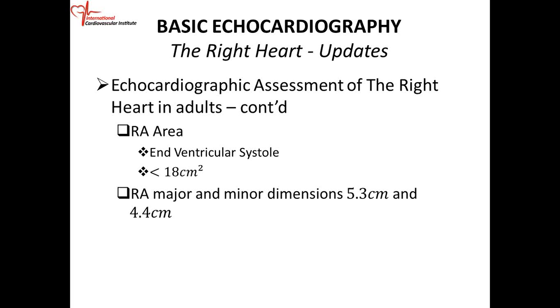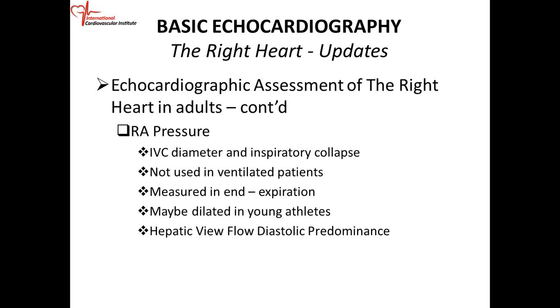You can memorize these figures. However, the most important figure to memorize here is the right atrial area, which should be less than 18 centimeters squared. Okay, it is done in end systole, ventricular systole, just like the left atrium.